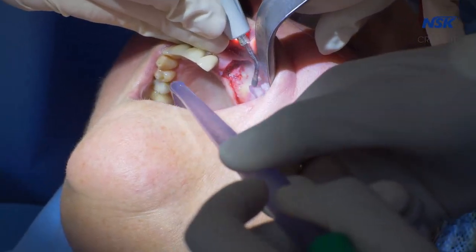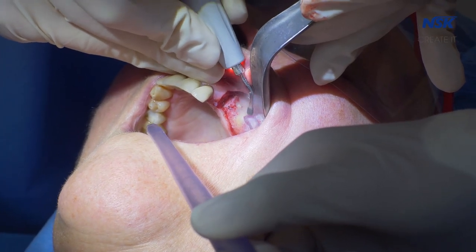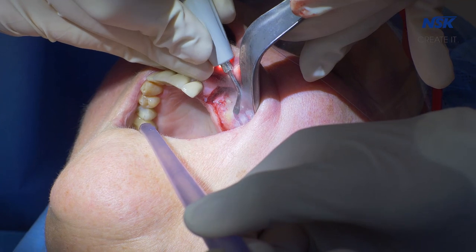You use the piezo to make the window, you can use it to elevate the membrane — there's a lot of control and power within the unit. Patients actually find it nicer because it's like having their teeth cleaned with the vibration, rather than feeling like their skull is being drilled. I really love using the kit. Sinus lift procedures can be tricky, but they're fairly stress-free with the Variosurg. If my piezo is broken, I guarantee my blood pressure will be going up having to use the surgical handpiece. It is wonderful.